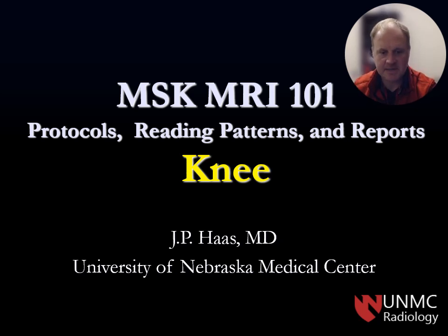Hello, I'm JP Haas. I'm one of the musculoskeletal radiologists at University of Nebraska Medical Center. This is MSK MRI 101, Protocols, Reading Patterns, and Reports, focused on the knee.